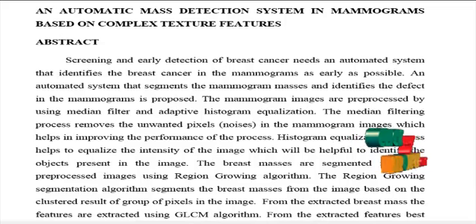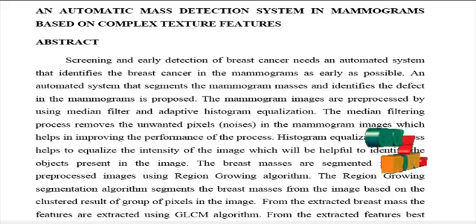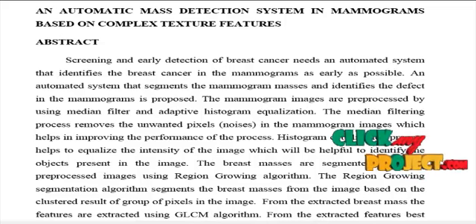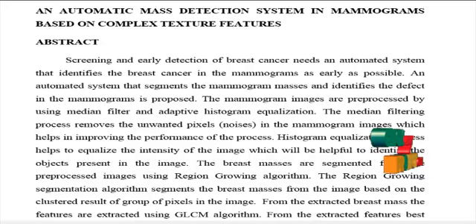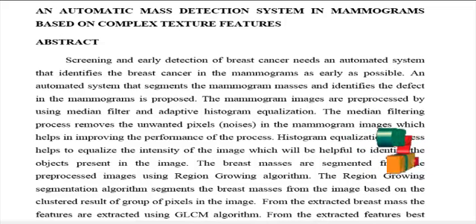Let me see the abstract of the process. Screening and early detection of breast cancer needs an automated system that identifies the breast cancer in the mammograms as early as possible. An automated system that segments the mammogram masses and identifies the defects in the mammograms was proposed.